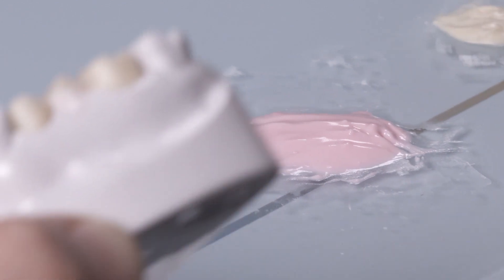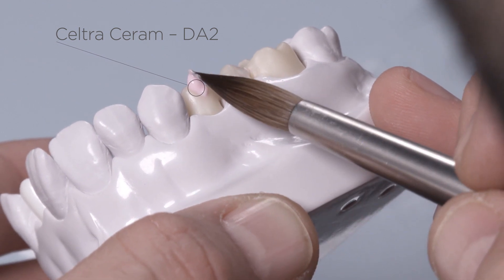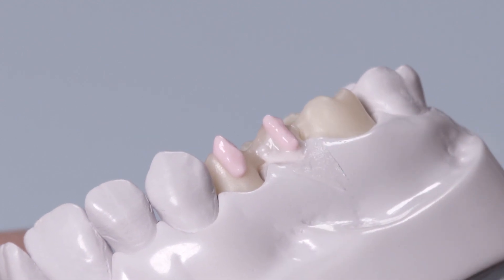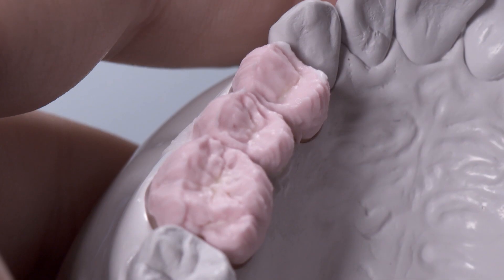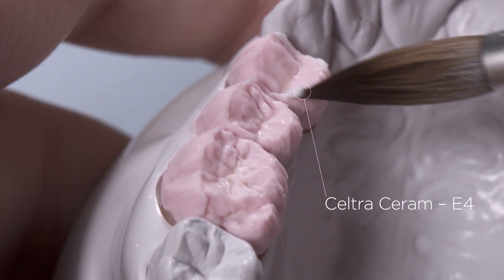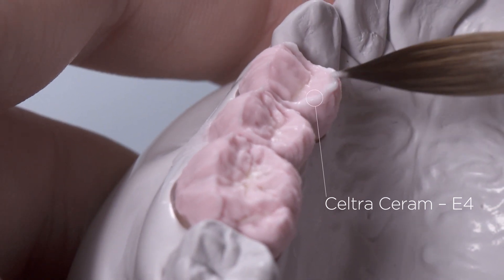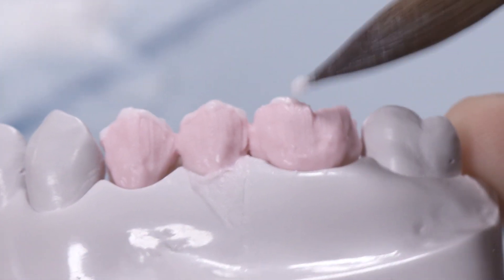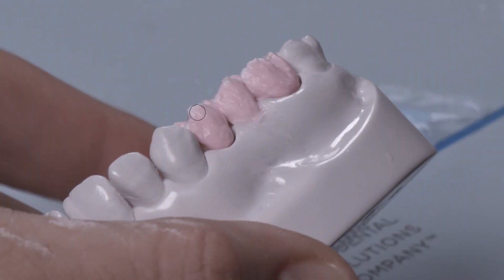Place Dentin Effect DE9 Orange in the central occlusal areas of the restoration. Then build up the buccal, labial and occlusal dentin aspects with Dentin A2. The ridges of the occlusal surfaces are emphasized with Seltra Ceram Enamel E4. This makes the occlusal surfaces appear extra vivid in the most translucent areas. Complete the build up with Enamel E1.